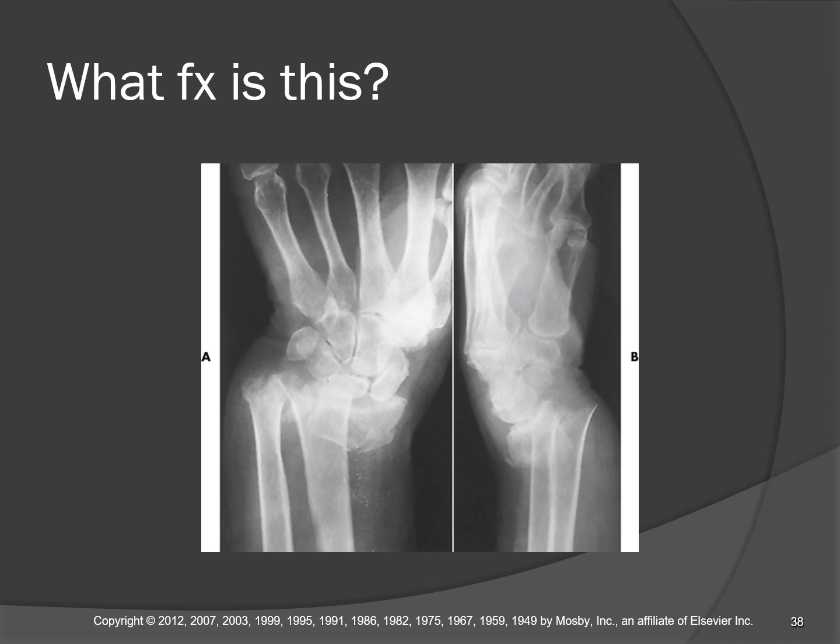Okay, Colles fracture, 2 views at 90 degrees are adequate. That's all they need to confirm for a Colles fracture. A transverse fracture of the radius, that's confirmed in picture A. Ulnar styloid process is avulsed, that's also confirmed in picture A. Picture B, the lateral, confirms posterior dislocation of the distal anatomy. The carpal bones and the bones of the hand, the entire hand, is posterior to the forearm now, from its normal alignment. So this is a posterior displacement with fracture. This is a Colles fracture.